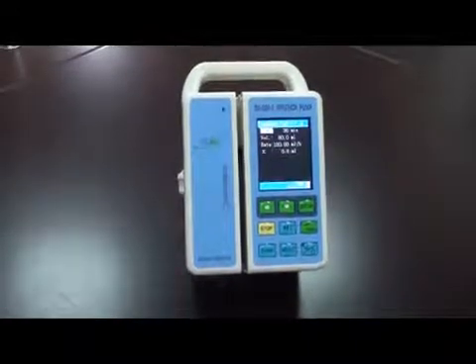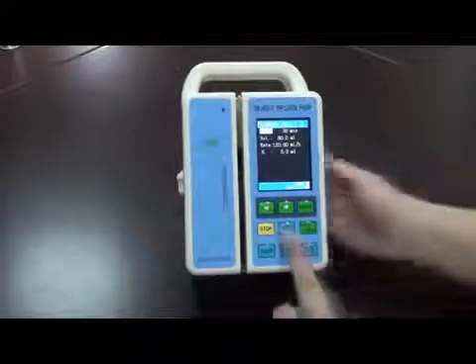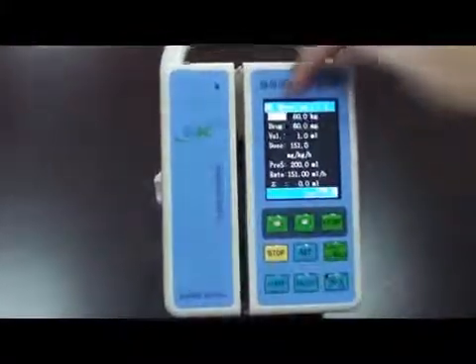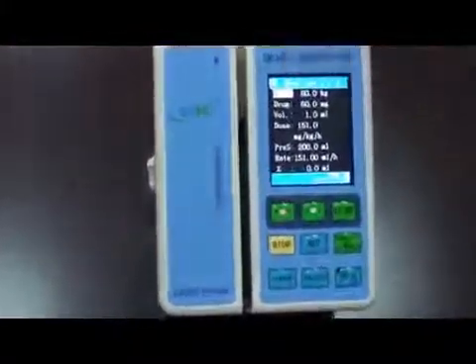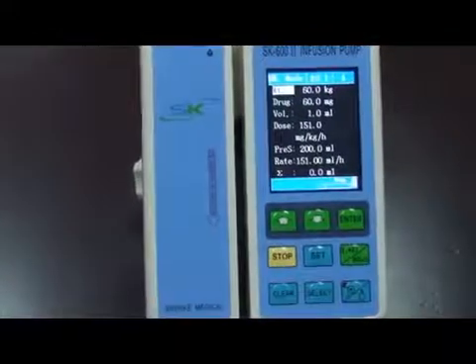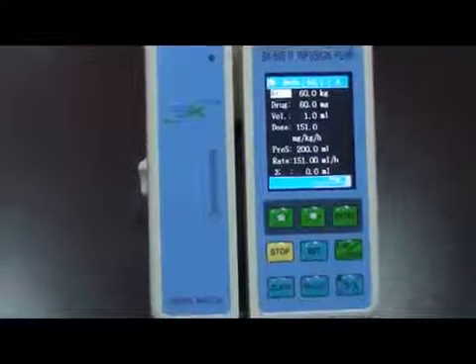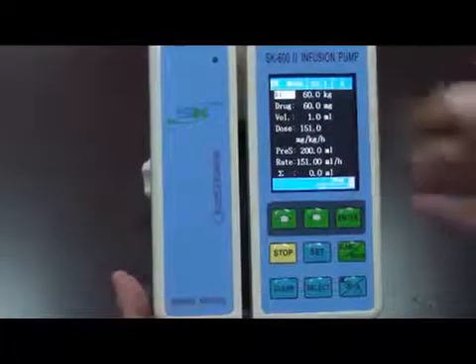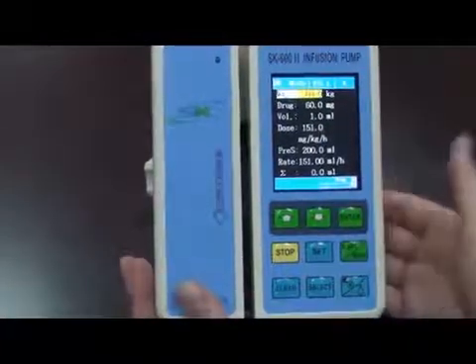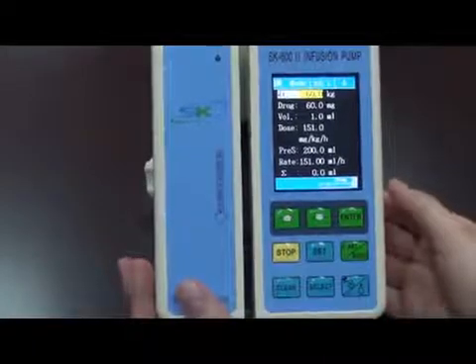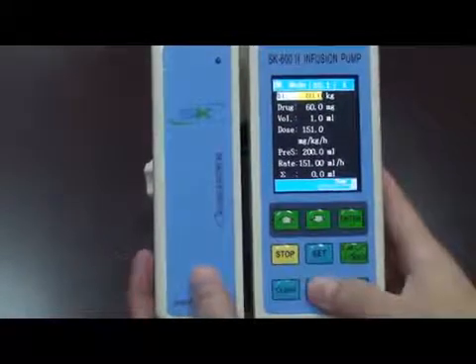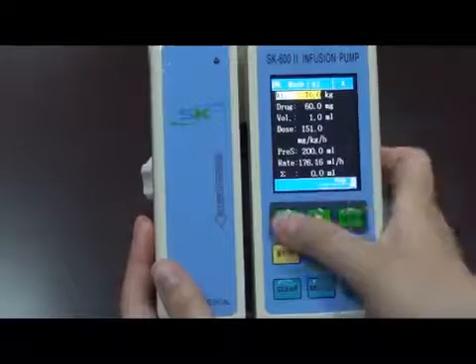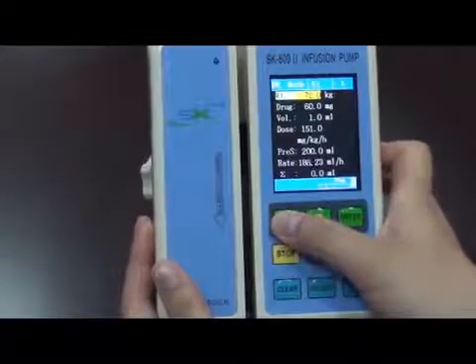Next we come to body weight mode. Press the set key again — BW mode, body weight mode. For this mode, a lot of parameters need to be set. The first one is the weight of the patient. For example, let's set it to 75kg.